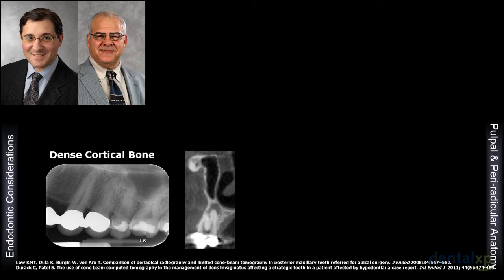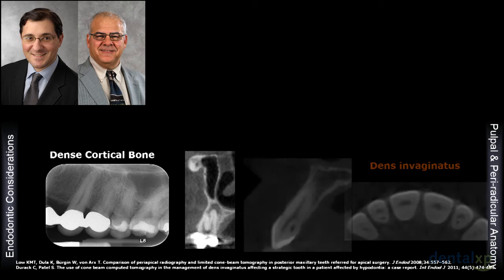This happens to be my hygienist who is having pain at tooth number 13, but on the periapical radiograph it doesn't look all that ominous. However, when you consider the cross-sectional anatomy, it's obvious the palatal root has a periapical pathology, but it hasn't blown through the buccal cortical plate. Because that's intact, you don't appreciate it on a 2D perspective.